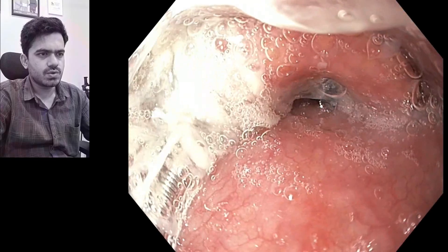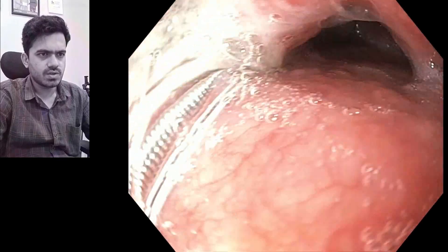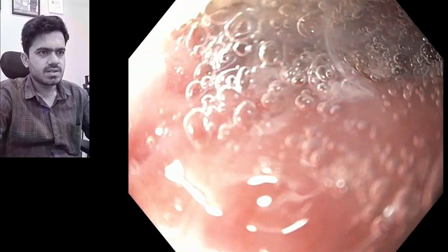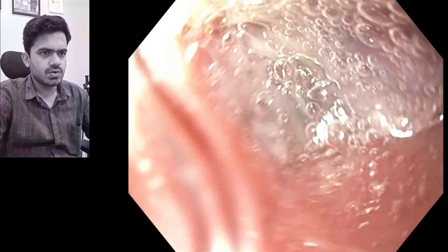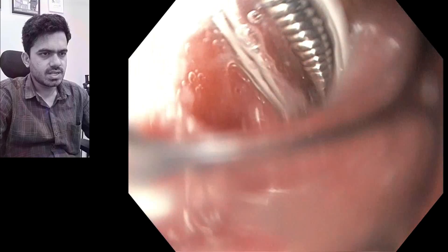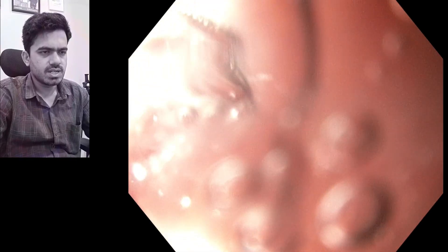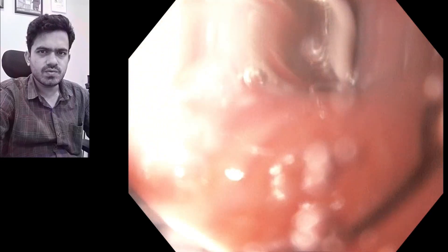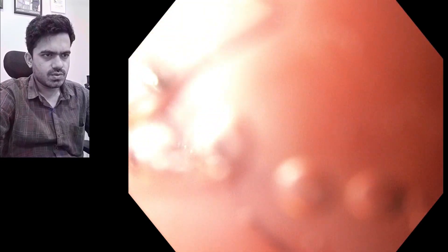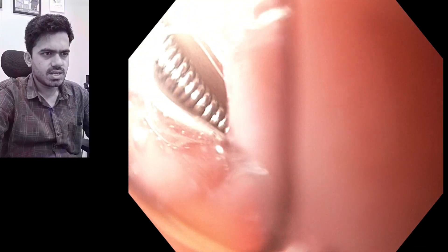We have negotiated the Ryle's tube through the nostril, and here you can see it is passing into the esophagus. We are trying to negotiate the scope parallel to this tube to visualize how it's entering into the esophagus. This is the area of the cricopharyngeus sphincter, so we try to gently push it and enter into the esophagus.